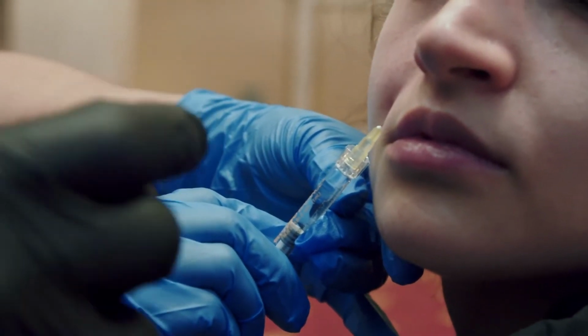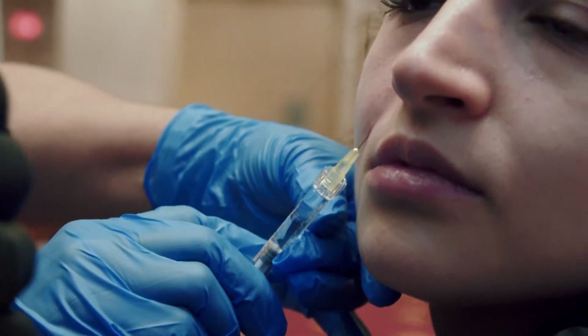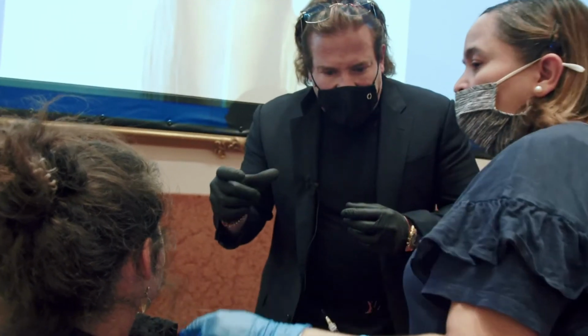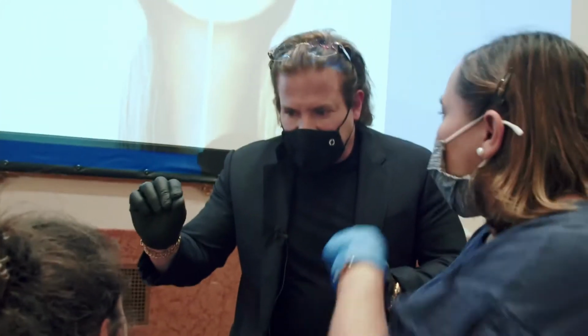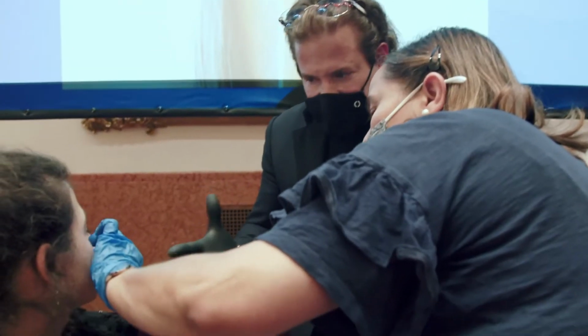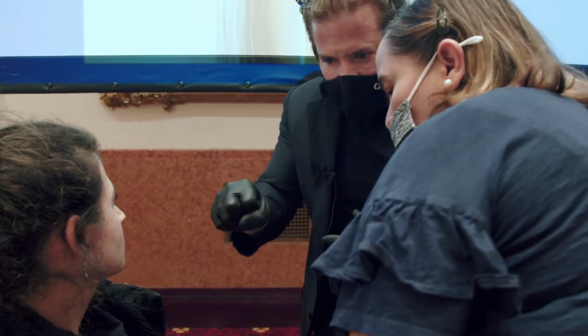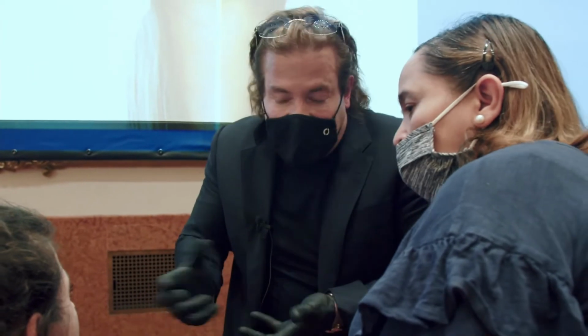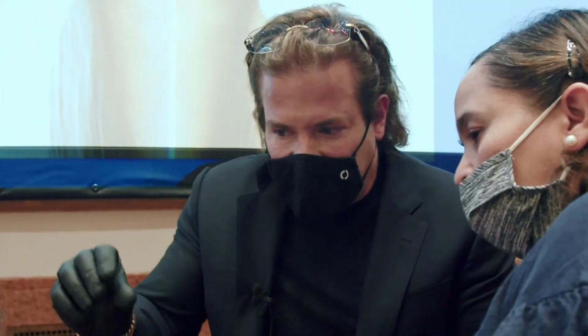A lot of people are not familiar with the pressure of the syringe, and you have to press kind of hard to get the product out. And you didn't do this, but you never want to inject a bolus in one area. You want to make sure you're moving. There are many reasons for that. One is cosmetic, aesthetically, but for safety reasons, if you put a whole bolus in one area, potentially you could compress a blood vessel. And you don't need to do that. So you're injecting as you're moving.